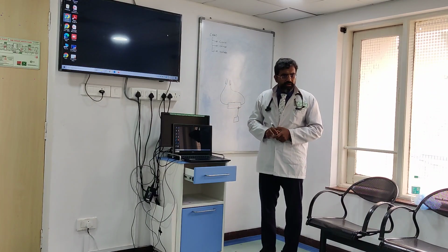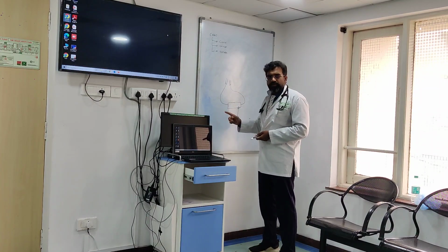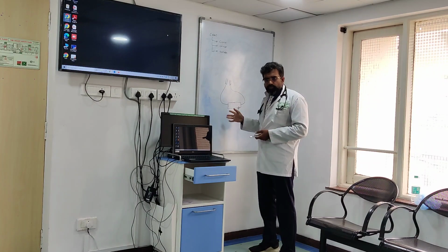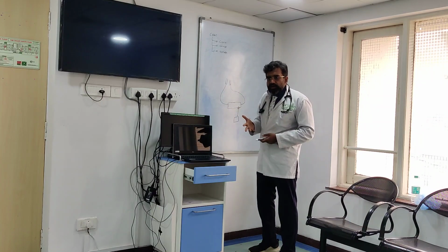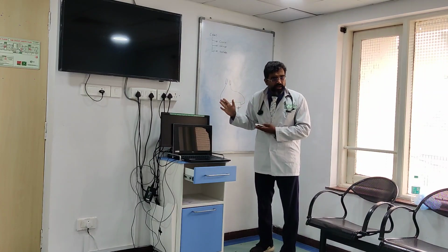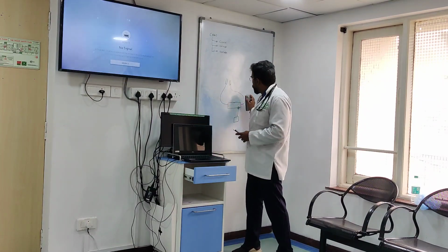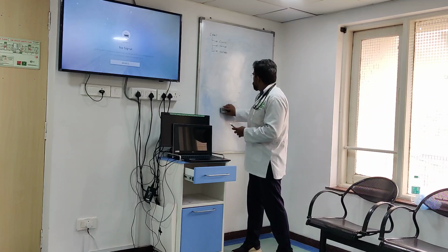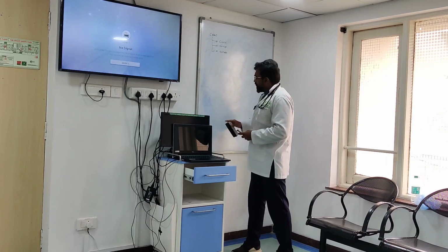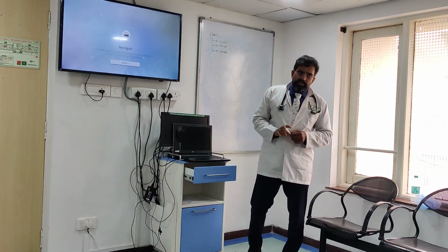You understand? But you know that this is going to be very inferior because you don't have a pump here. You don't have a pump to move this. So if you don't have a CRRT machine, you may want to use it. I have done it, where you apply it and dialysis kind of works. At least your dialysis modality will work, diffusion will work. Some filtration will work. So CAVHD, but we never do CAVHD. We have come out of the CAVHD mode now.